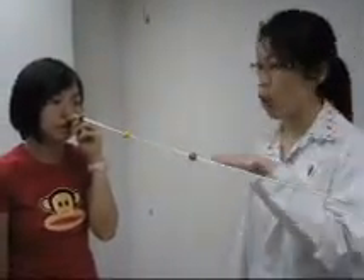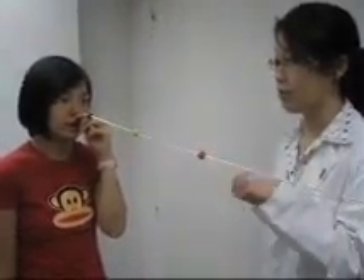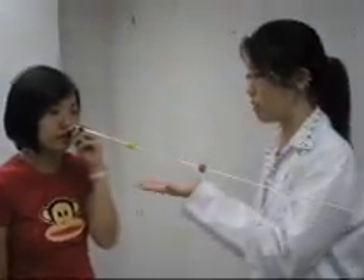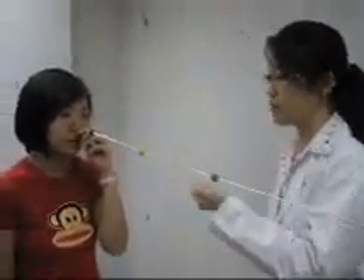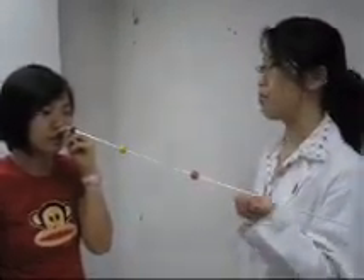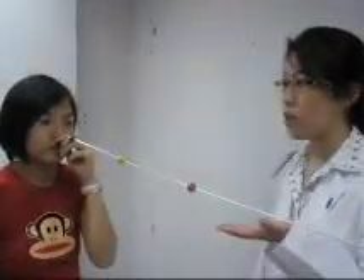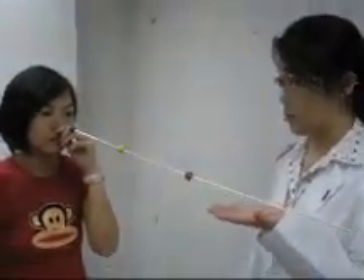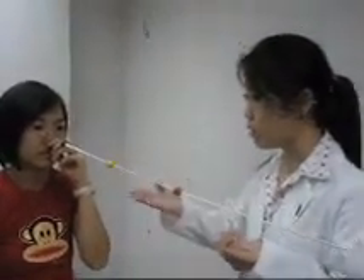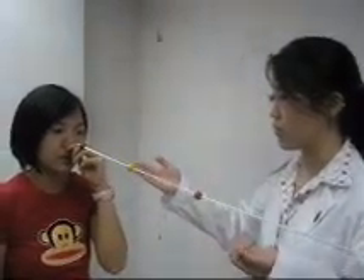Please look at the red bead. How many red beads do you see? I can see one red bead. Still focusing on the red bead, how many yellow beads can you see? I can see two yellow beads. Still focusing at the red bead, how many green beads can you see? I can see two green beads. Still focusing on the red bead, is the separation between the yellow bead or the green bead larger? The separation between the green bead is larger.